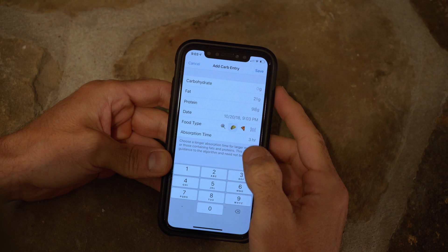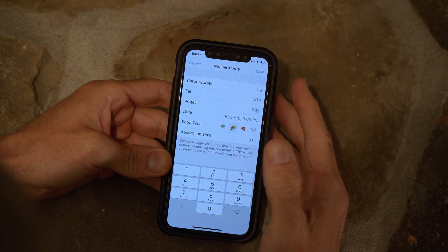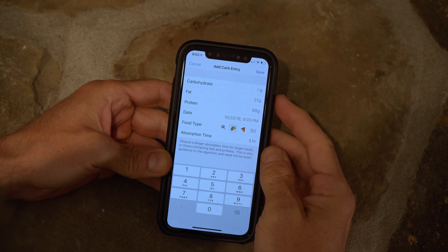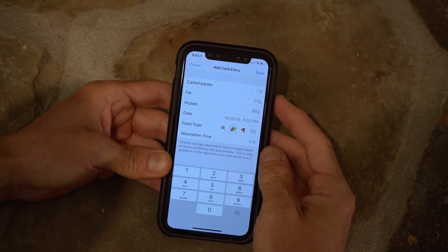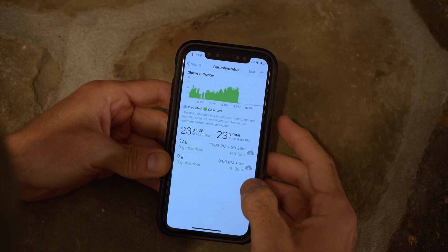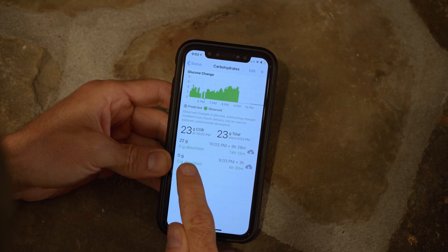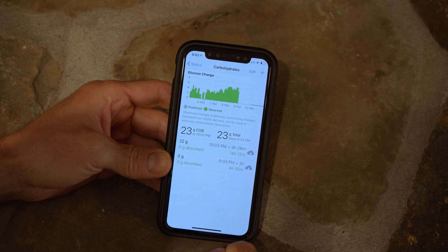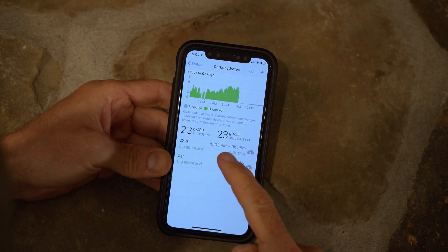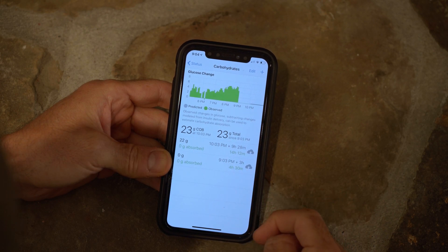Loop will treat this differently than the pizza example because it is less than 40 grams of carbohydrate — a threshold that research has shown to be important. For zero grams of carb, the fat and protein effect is half that of meals with a large amount of carb, and it ramps up between zero and 40. If we hit save, it shows an immediate entry for zero grams of carb — logged as 0.1 grams as a reference point for when you ate, in case you later want to see that in Nightscout. One hour into the future, it is providing 22 grams of carb equivalent absorbed over 9 hours and 28 minutes.